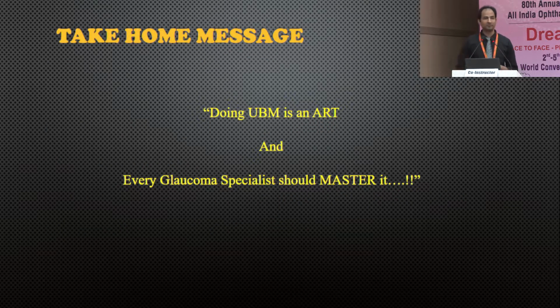So the take-home message for today is doing UBM is an art, and every glaucoma specialist should master it, as UBM can unravel many mysteries underneath the cornea. As in childhood glaucomas, the corneas are mostly not very clear. So to find what is beneath it, a UBM can be a really good tool.